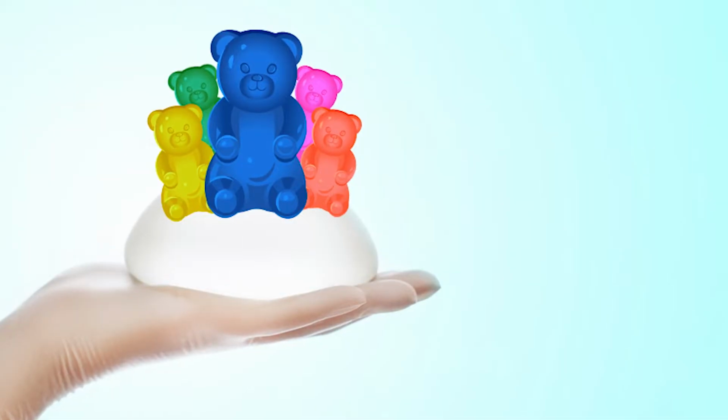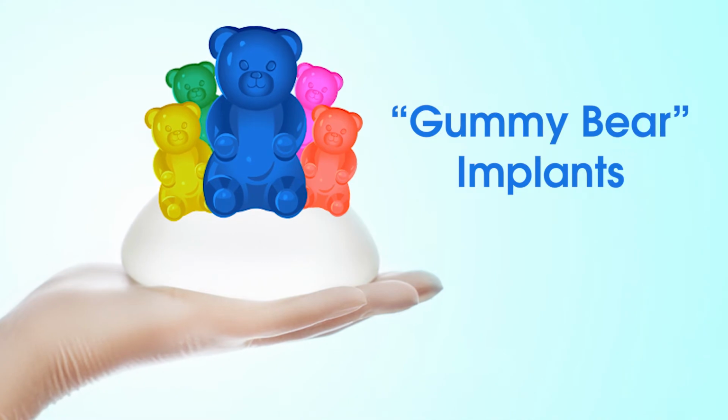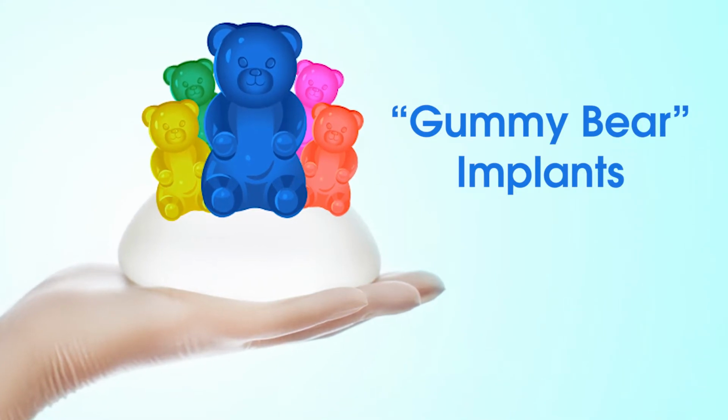Jason, you mentioned gummy bear implants. It's the worst term in the world. Actually, I gave a presentation a few years ago about, will the real gummy bear implant please stand up? And at the end, I said we should just abandon the term because it's such a bad term, but it's all over the internet and patients use it all the time. And it just means these more cohesive gel implants, but it's really more just a marketing term.